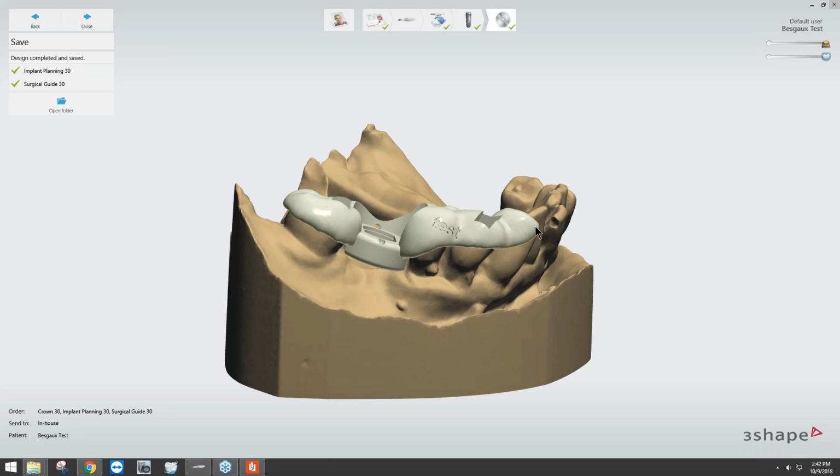Right now, the guides are FDA compliant based on whichever printed material you're working with. The important thing when it comes to FDA compliance is making sure that you're not just recording your manufacturer's FDA clearances, you need to record your own process for intaking cases, designing it, generating your files, printing. All of that has to be recorded down in your own personal documentation to make sure that you are FDA compliant. As long as you're recording everything and everything's being done consistently, that should be enough for the FDA.